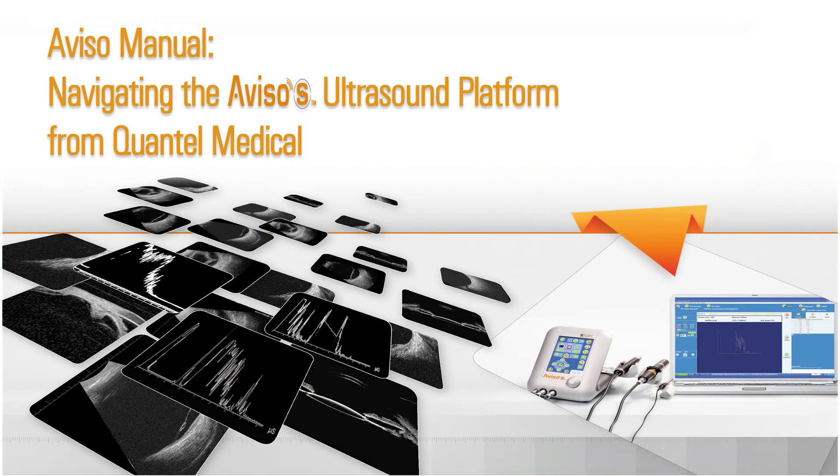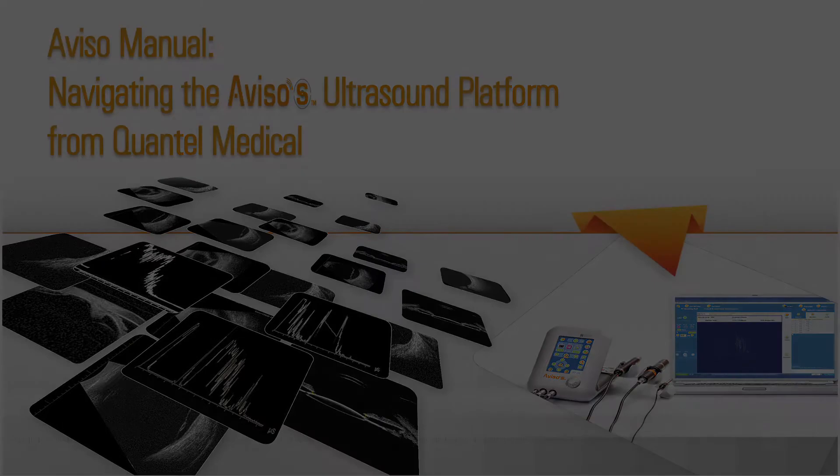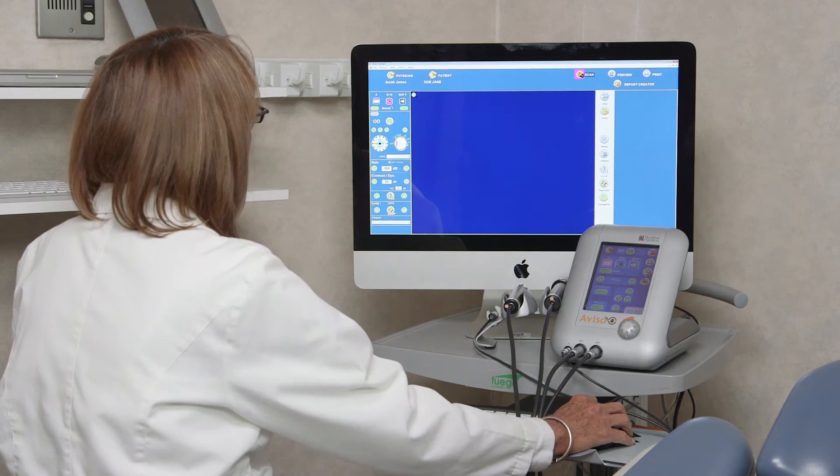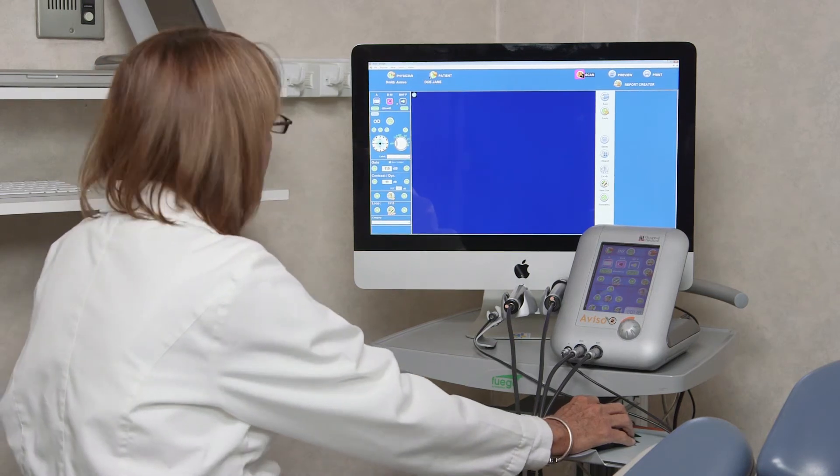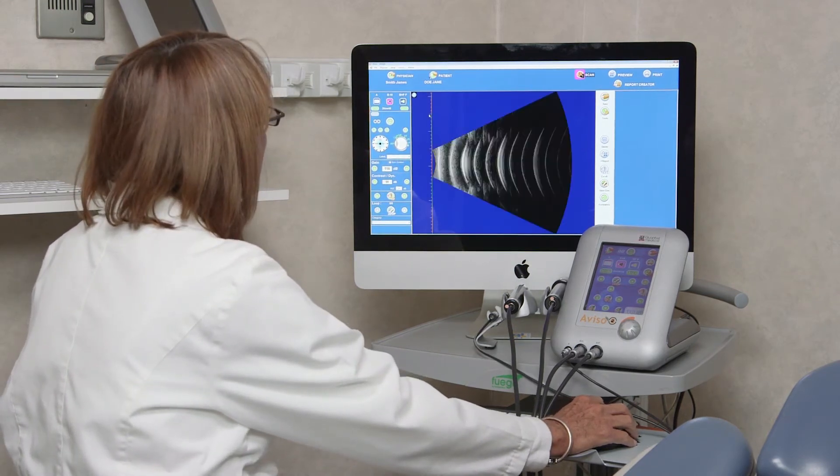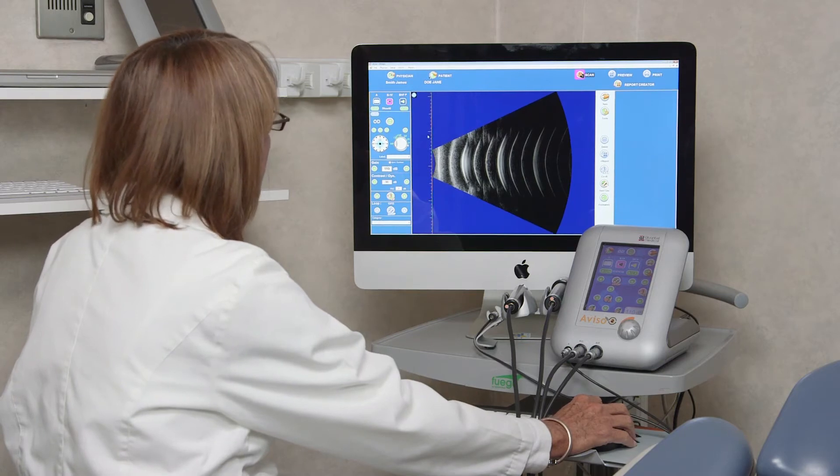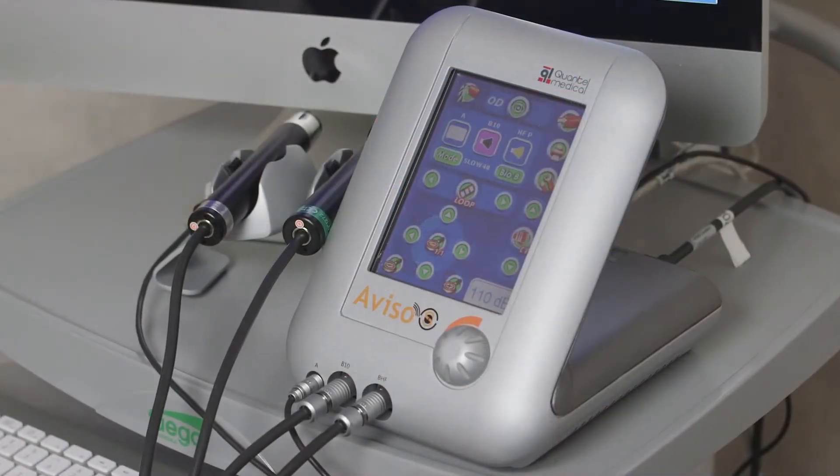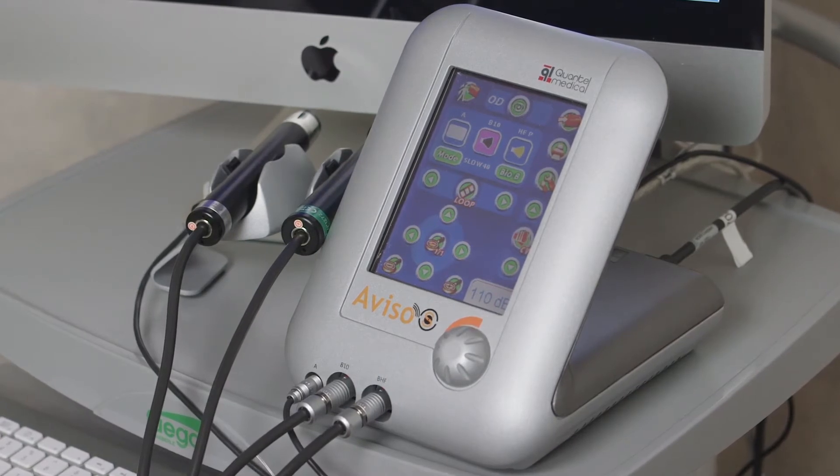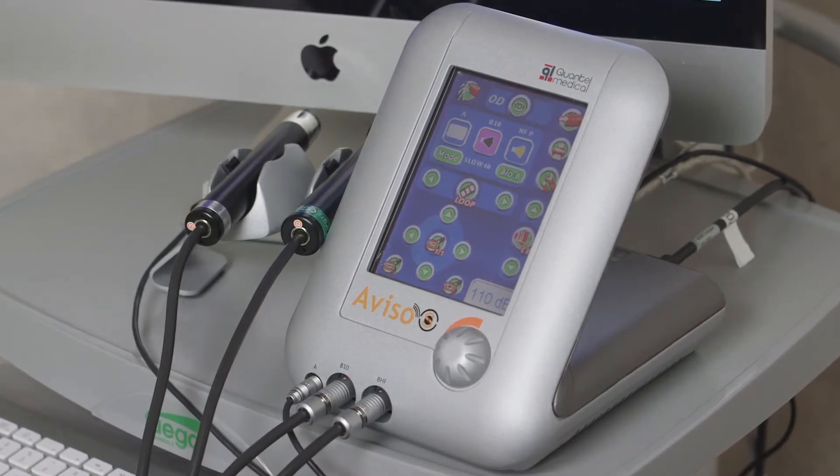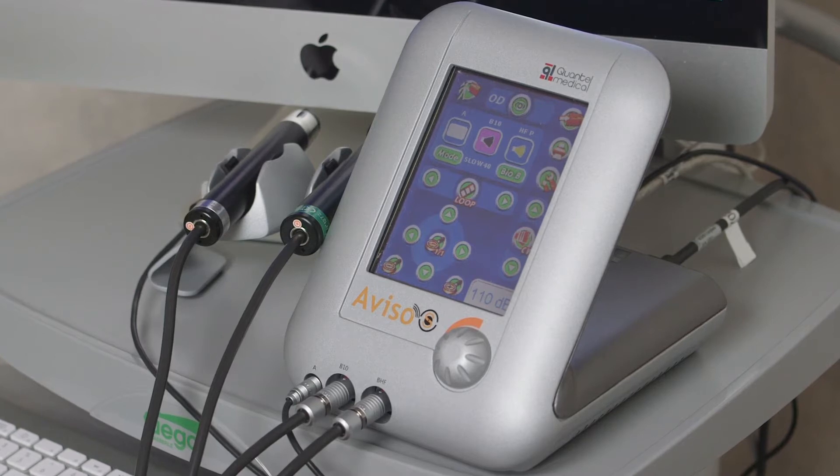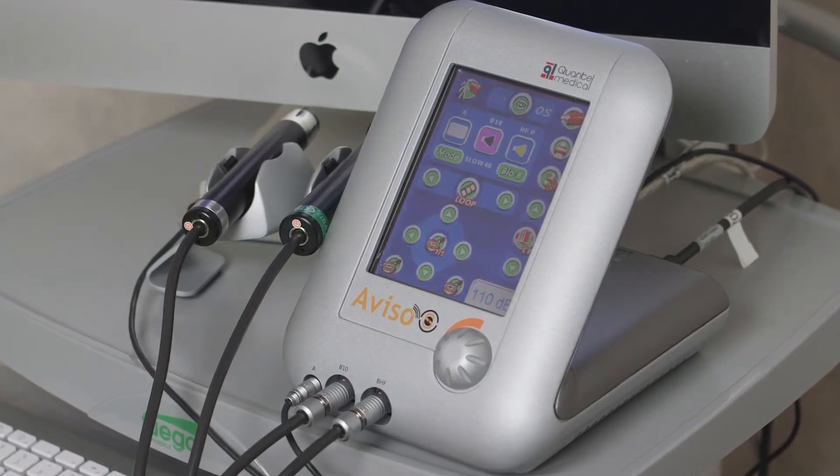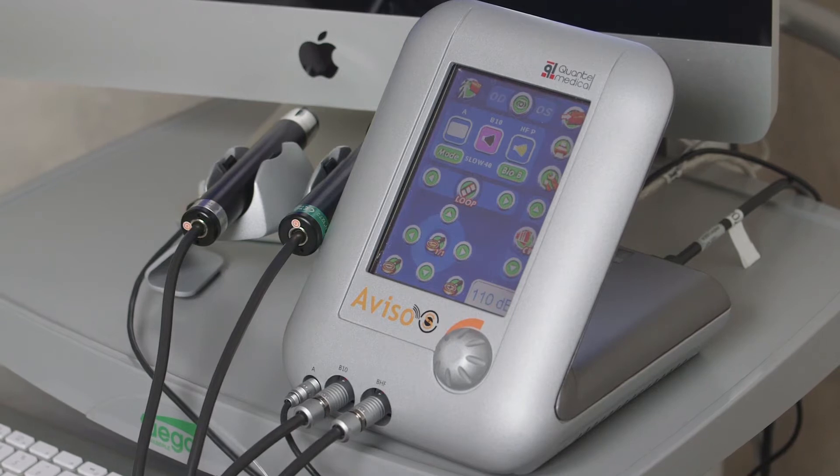Aviso Manual: Navigating the Aviso-S Ultrasound Platform from Quantel Medical. This video will introduce the Aviso-S Ultrasound Device from Quantel Medical, covering some particulars of its hardware and software, and demonstrating the use of key features. The Aviso-S is a compact, comprehensive ultrasound platform with a user-friendly touchscreen interface. The module can be used for B and A scan, or biometry and standardized echography, and ultrasound biomicroscopy, or UBM.